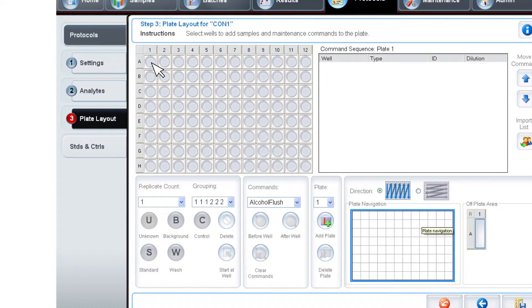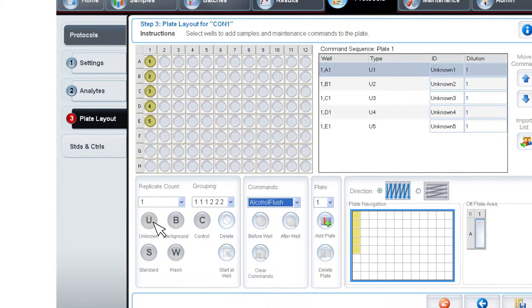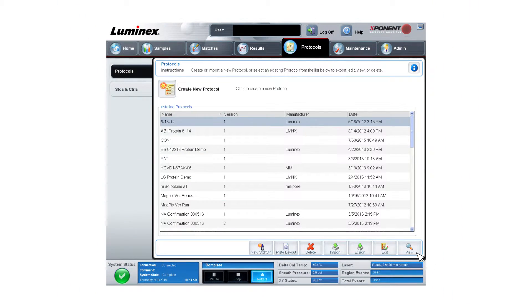Select the first five wells of the first column on the Plate Layout page. Click the U icon to set these wells as unknowns. Click Save to save the protocol.